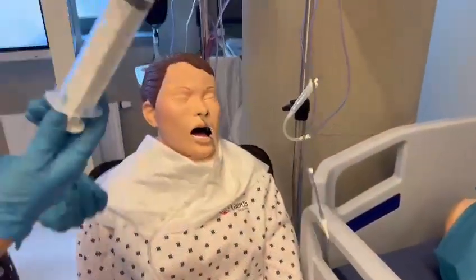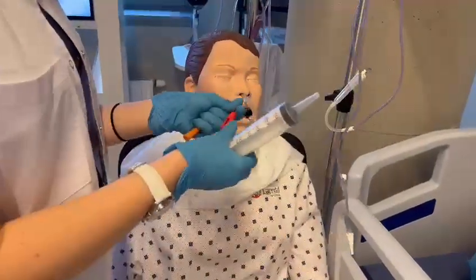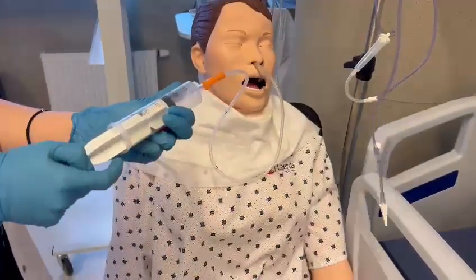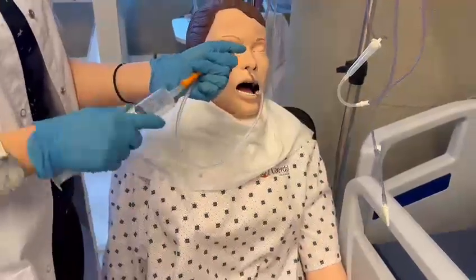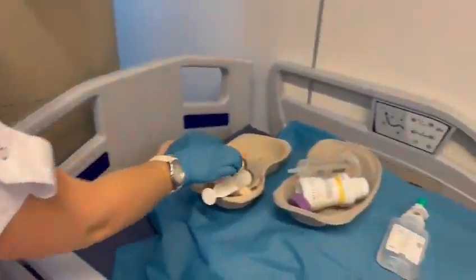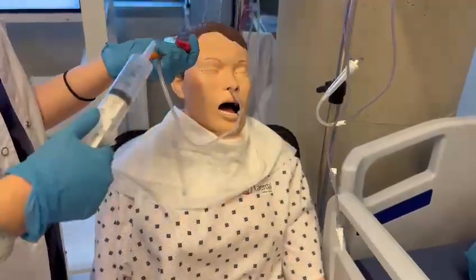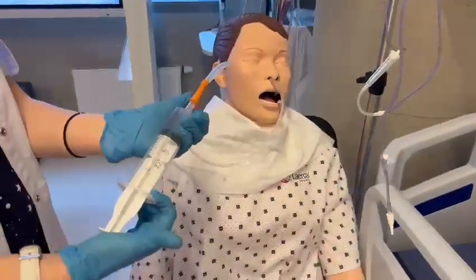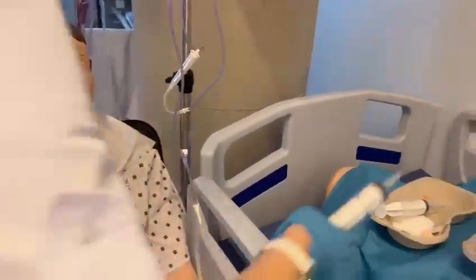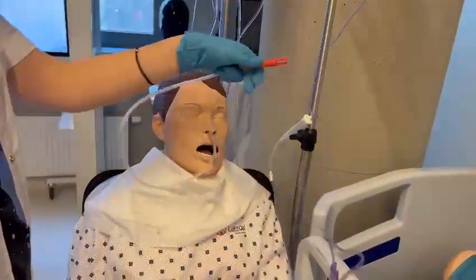Before feeding, we have to check the location. We check the location with an empty syringe — aspirate. Now I close, and then I flush with another saline syringe and close.